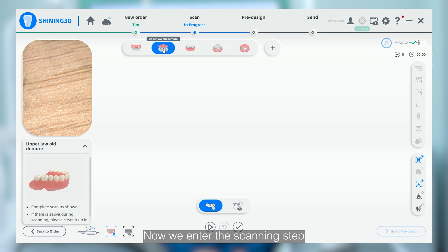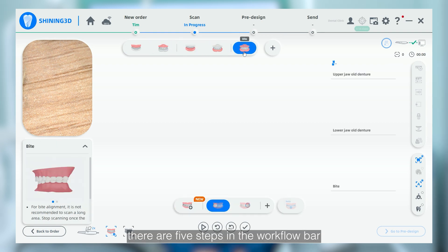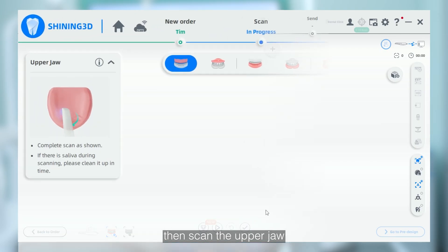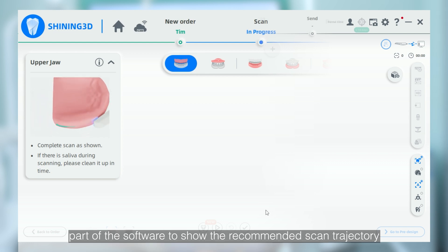Now we enter the scanning step. There are five steps in the workflow bar. Just follow it. Before starting, remove the old denture from the patient, then scan the upper jaw. There is a video on the left part of the software to show the recommended scan trajectory.